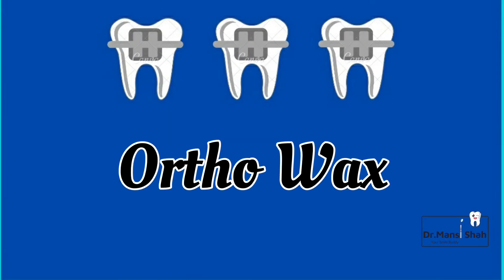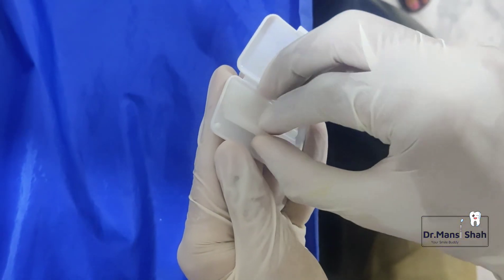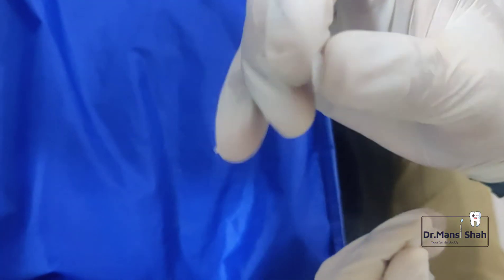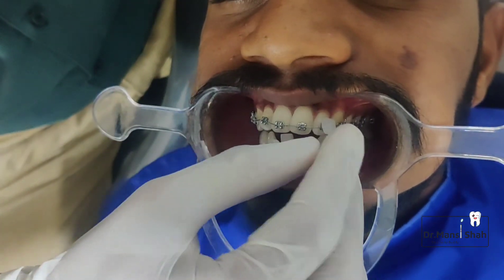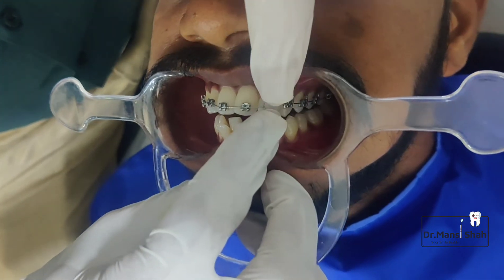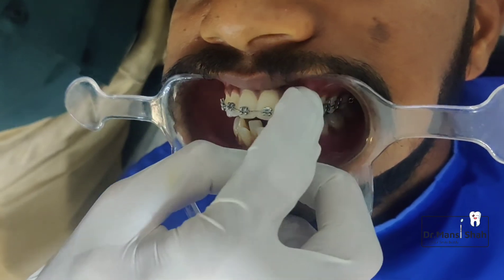The next is not a compulsory step. If you are having an injury or your braces are hurting your soft tissues, take a pinch of ortho wax, hold it between your fingers, and make it into a soft ball. Place it on the bracket that is hurting. Remove it before having food or brushing. There is no problem if you swallow it accidentally, as it is not harmful.